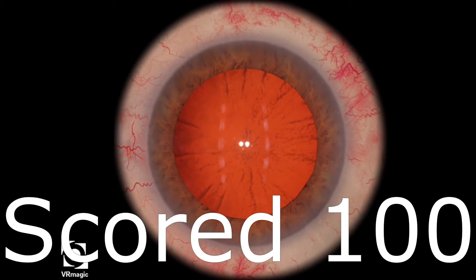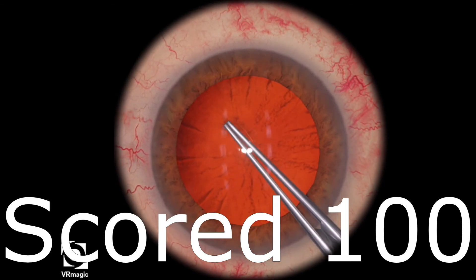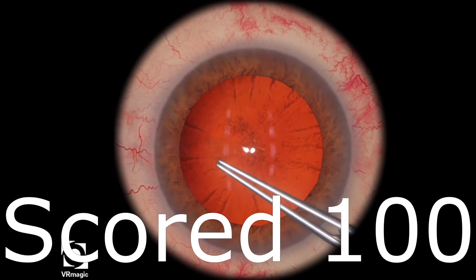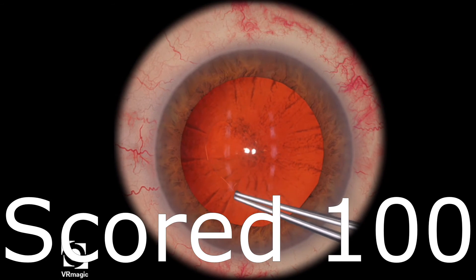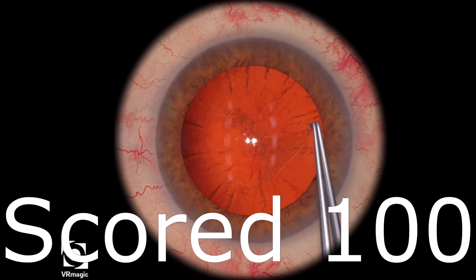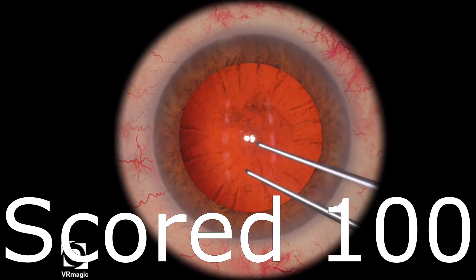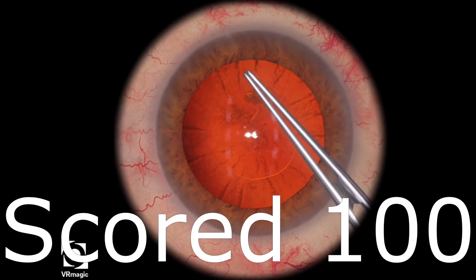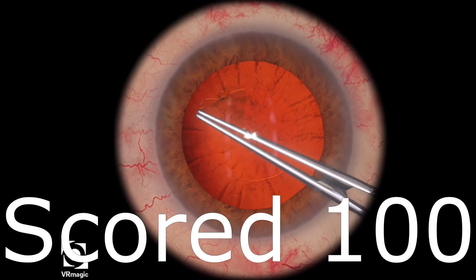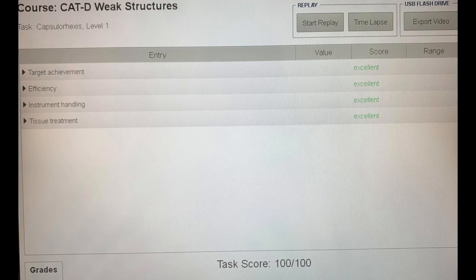So let's take a look at that one more time. Again, this is one of my favorite levels in the simulator because it just teaches you consistency. You want to try to create the flap the same way each time, with the same instrument and in the same pattern, so that no matter what kind of tension or zonules they give you, you're still able to create the same perfectly round rhexis. I think that is one of the hardest parts of the simulator, and probably one of the hardest parts of cataract surgery, from what Dr. Chung and Dr. Warren have spoken to me about.